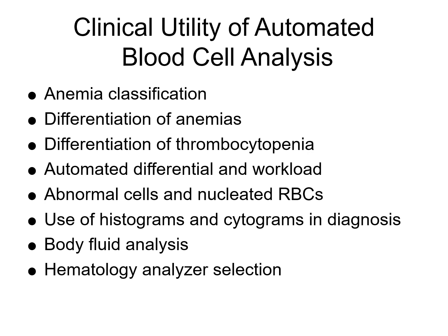The use of automated white blood cell differentials can significantly reduce manual workload in clinical laboratories. It can increase efficiency and throughput. Flagging systems within analyzers alert technologists to samples requiring manual review, ensuring abnormal cells are not missed.